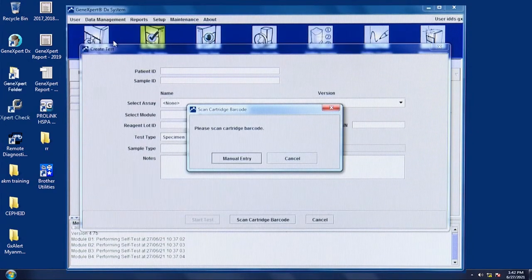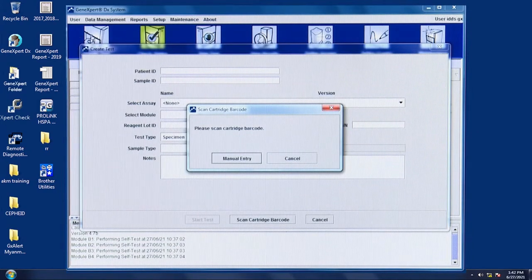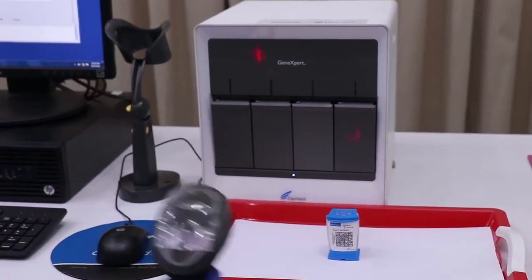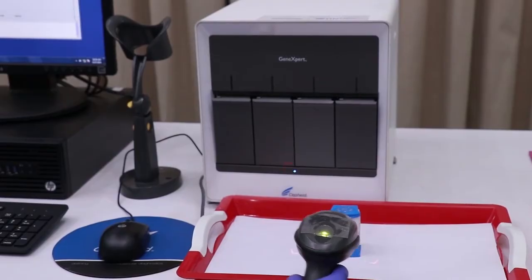When the Scan Cartridge Barcode dialog box appears, scan the barcode on the Xpert MTB-RIF cartridge with the barcode scanner. A beep sound will be heard.